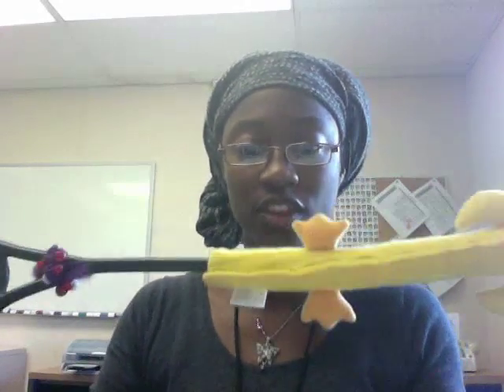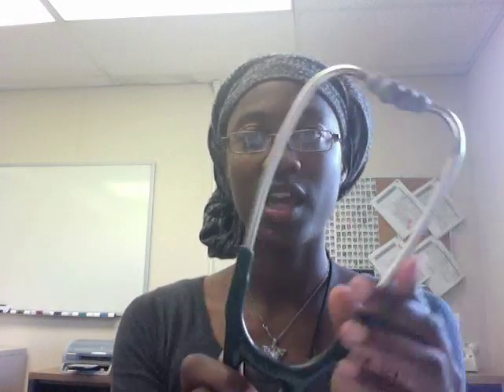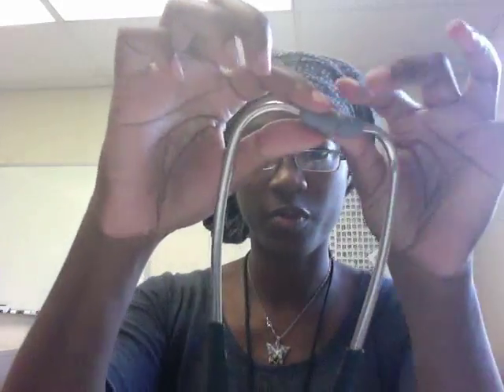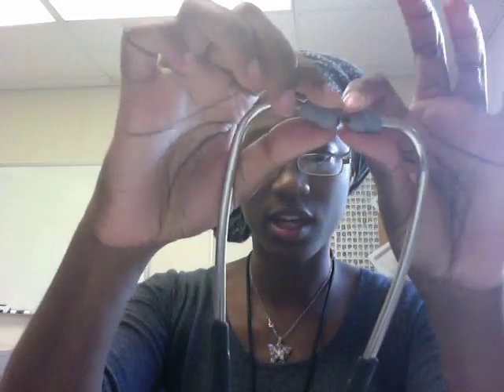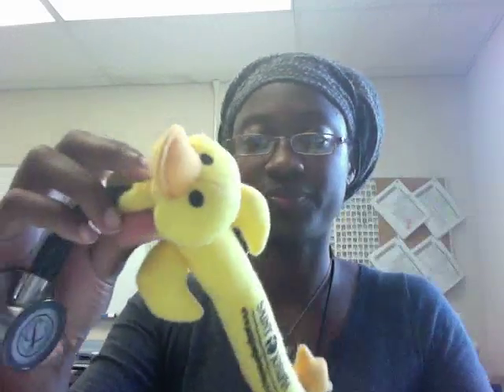The first thing I'm going to talk about is the basics of the stethoscope's anatomy. The first piece is the headset, and there are the ear buds, or the earpieces, here. The second piece is the tubing — this is where the sound is transmitted. And this is the head of the stethoscope.